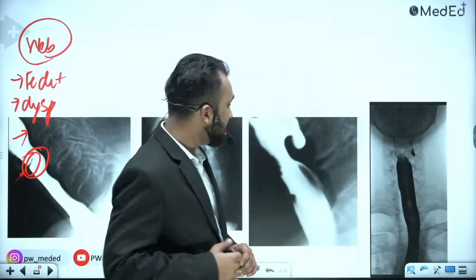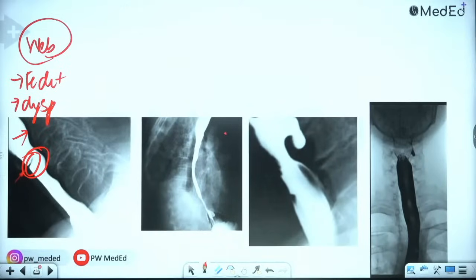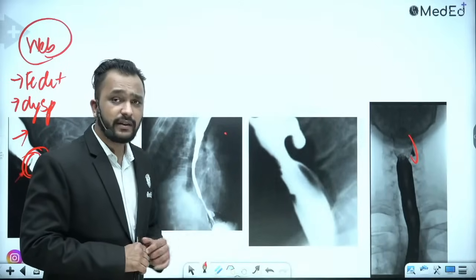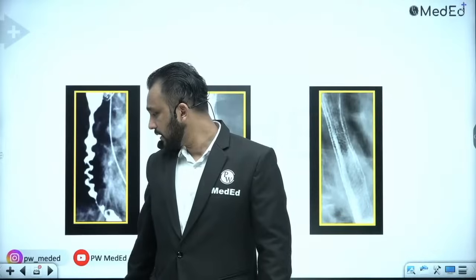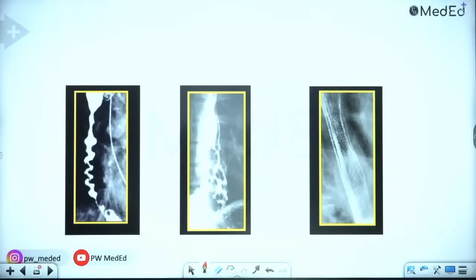And this is your Zenker's diverticulum. And when this diverticulum is arising from the lateral part of the esophagus, this is known as Killian-Jamison diverticulum. And remember that this diverticulum will be present below the cricopharyngeus muscle. Okay, very good. Dolman procedure for Zenker's diverticulum.